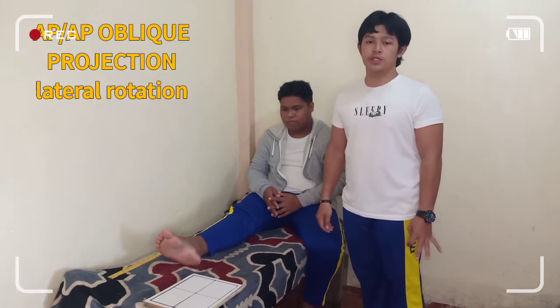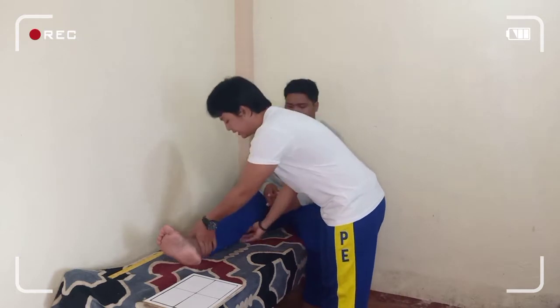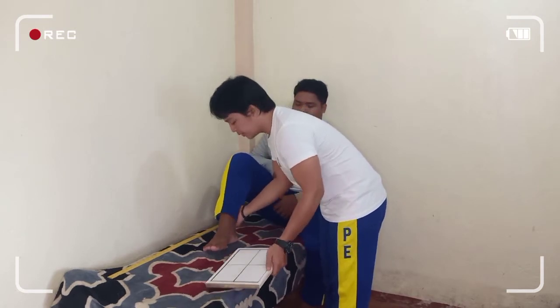The third projection of the foot is the AP oblique projection, lateral rotation. First, place the patient at the radiographic table in seated or supine position. Flex the knee on the affected side and place the plantar surface of the foot on the image receptor.